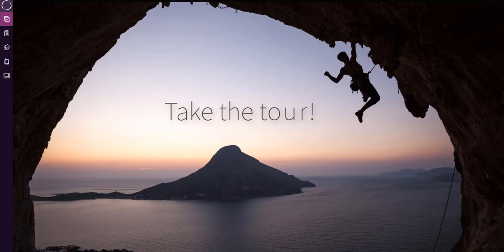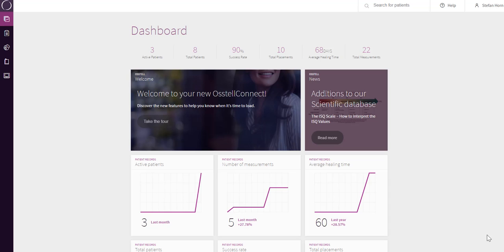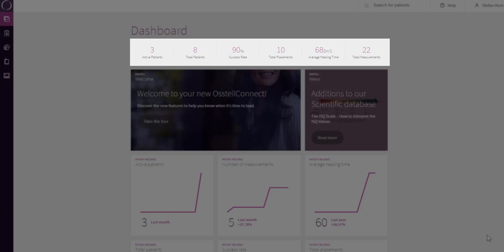Let us give you a tour. After logging in, you will come to your dashboard. The dashboard helps you to get an instant overview of your implant treatments in your clinic. On top, you will find some predefined key performance indicators that will change over time as you upload data from your ISQ devices.